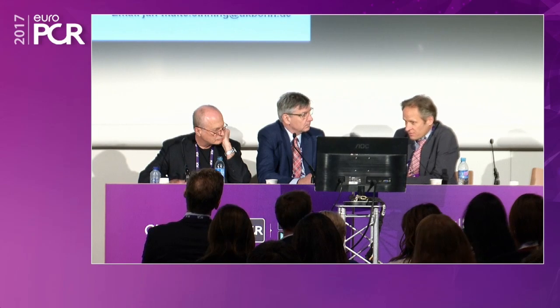Well, the presenters very nicely pointed out that for PVL, there's obvious data that we should avoid mild, moderate, and severe PVL, because that directly affects the outcome in terms of increased mortality at 1 year and in longer term studies. So it's very clear that that's number one. You shouldn't have PVL. And actually, we as surgeons were always told by cardiologists, when you put an aortic valve in conventionally, if there's a leak, that's a problem. You didn't do a good job. Having said that, pacer, there's studies indicating now that pacers won't have negative long-term effects, but 1 year effects. But I'm not sure whether we know that in the long run.